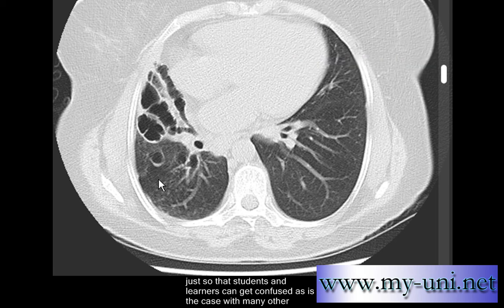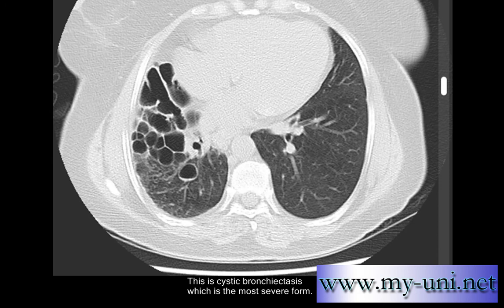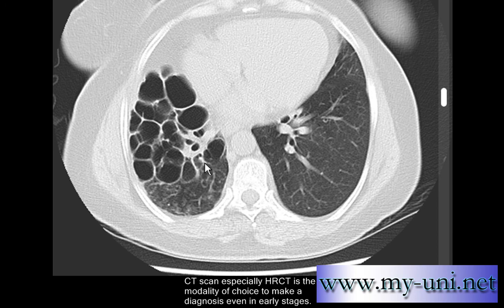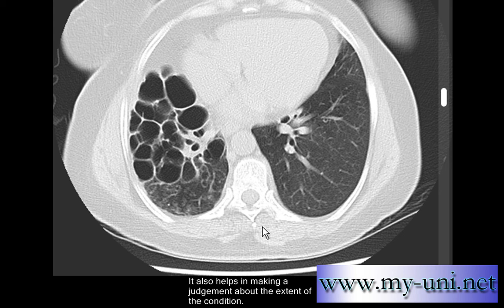The condition is classified into several types, and some types often have more than one name. This is cystic bronchiectasis, which is the severe form — notice the large number of cysts. Almost half or more than half of this patient's lung is non-functional. HRCT is the modality of choice to make the diagnosis even in early stages.